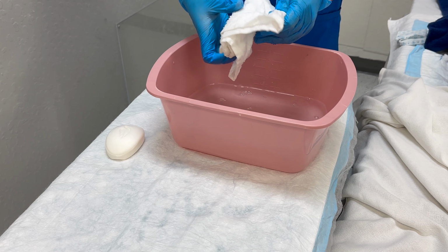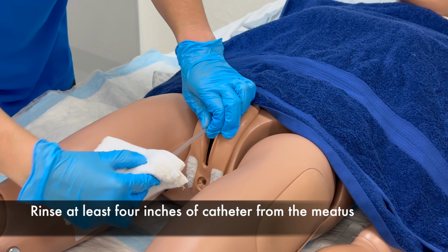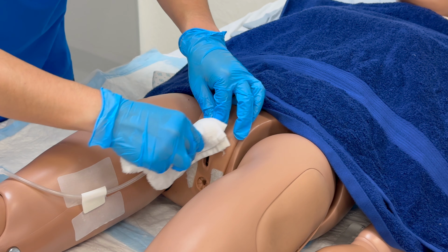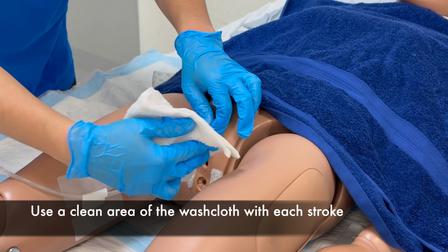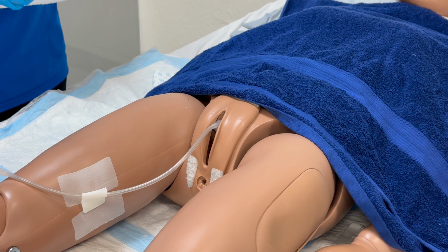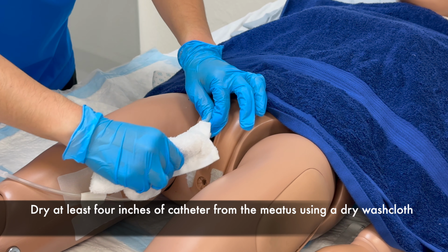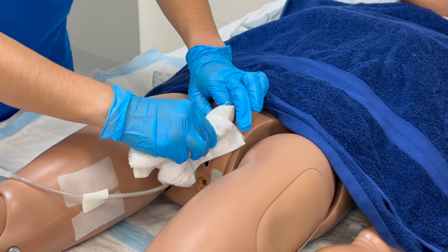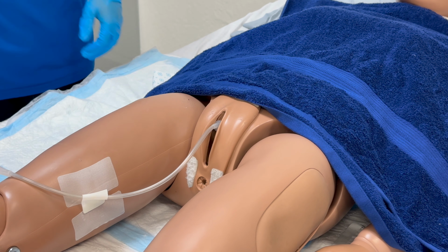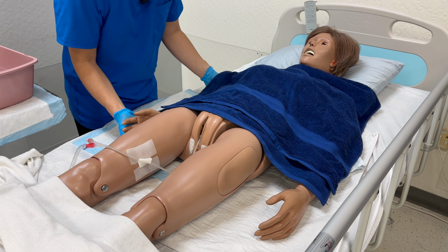Use another towel to rinse. The next washcloth is to rinse. The last washcloth is to dry. Mrs. Smith, I'm going to turn you to the side. On the count of 3, 1, 2, 3.